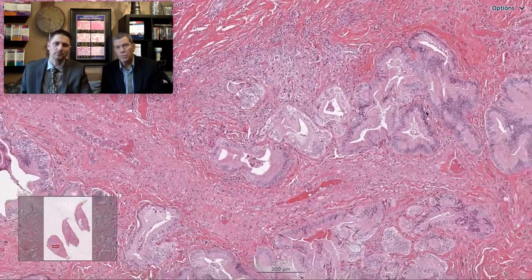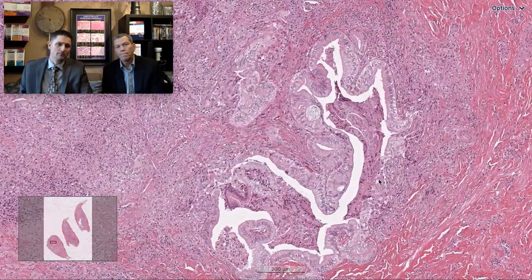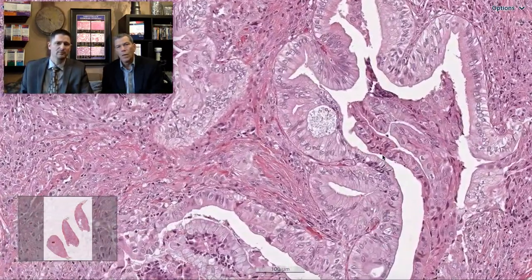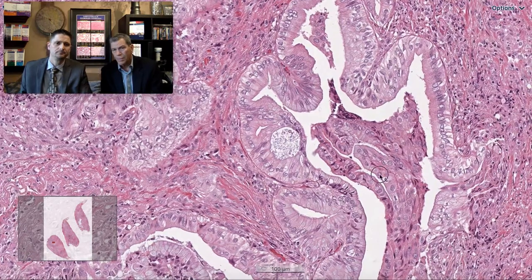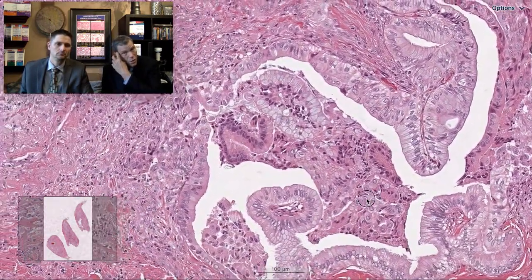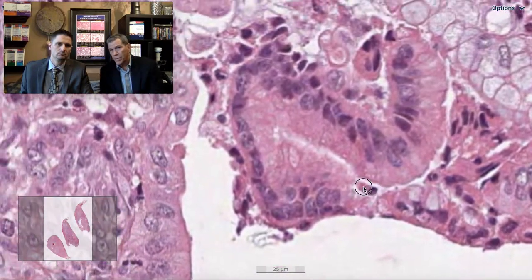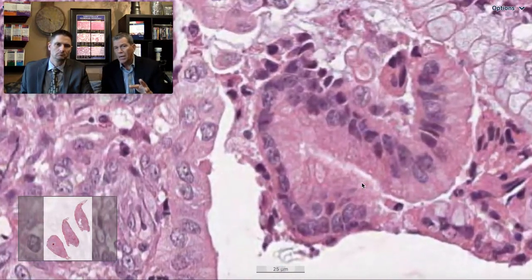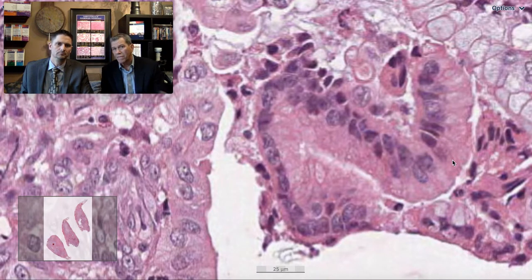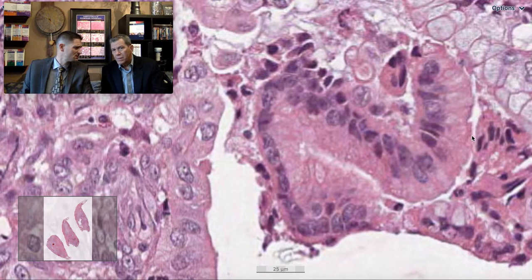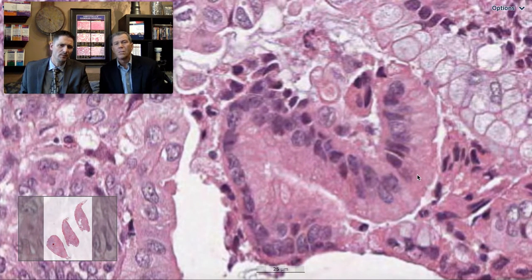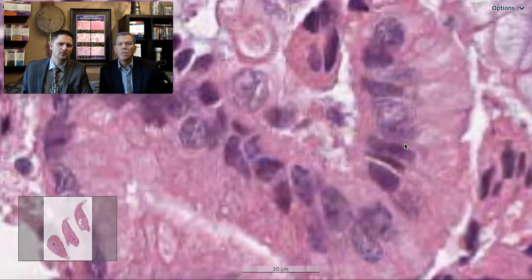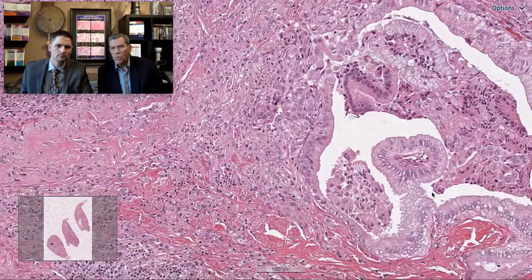If we're looking for tumors, we do have some glandular epithelium here, but this might just be peribronchiolar metaplasia. Whenever I see glandular epithelium in the lung with or without mucus, I look at the epithelium: I should be able to see cilia on at least half the cells in any field. So if I've got 50 cells, I should see distinct terminal bars and cilia. There might be a little bit of cilia right there — maybe one ciliated cell in this strip.